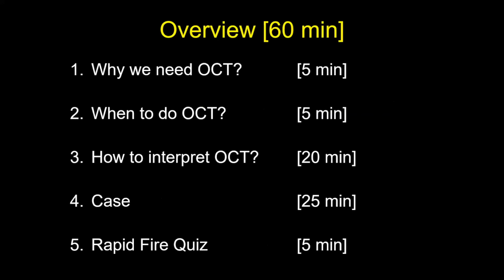Okay, I was told that it will be about 60 minutes, but we can reduce it as much as we want and we can continue all night. So just a few things that we would like to cover in this talk, and obviously how to interpret and cases, we can reduce if needed. And I thought we should have some interaction, so might ask the audience and the attendees a few questions, some quiz at the end.